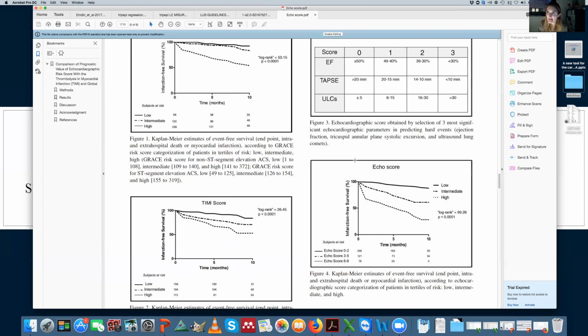And apart from this paper, I can tell you that, especially in patients with non-ST elevation MI, but also in STEMI patients, in the acute phase you are very concerned about the ischemia. You are not much concerned about the left ventricular function or the pulmonary congestion. And some of these patients have huge B-lines, especially those who didn't have a previous heart failure state. So they had a normal ejection fraction, their capillary membrane is not used to increased left ventricular filling pressure, and so they can develop a pulmonary edema very easily.